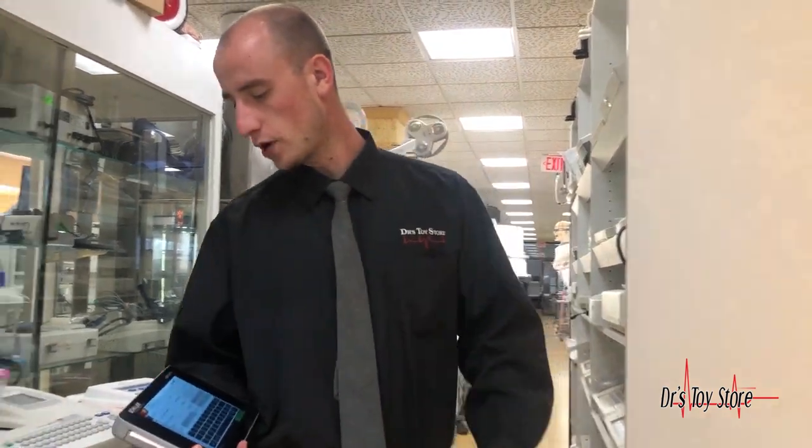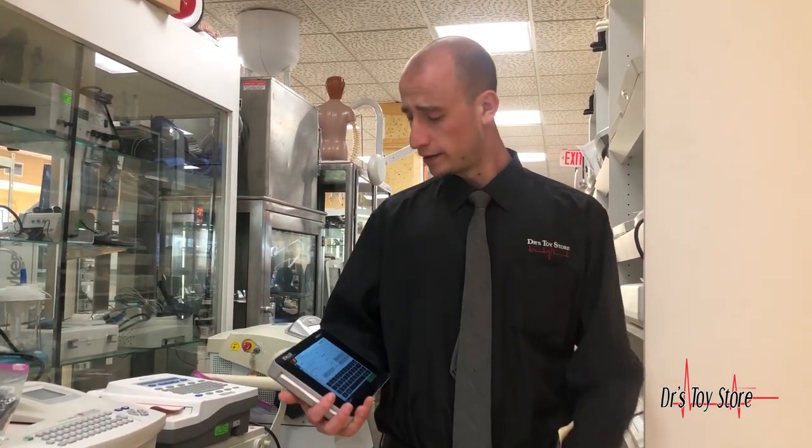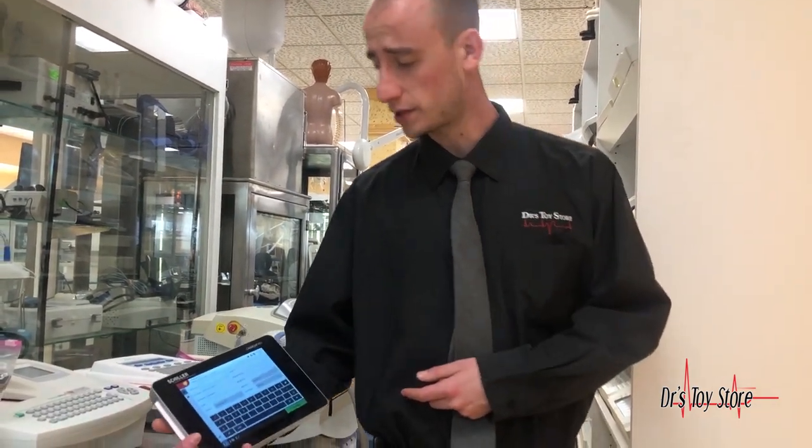Mike here with the Doctor's Toy Store. The Cardio FIT FT1 from Schiller is a new EKG with software that will blow your mind. This EKG has a three-step process, and we get really close here so you can see.